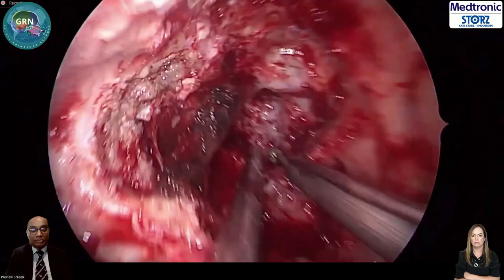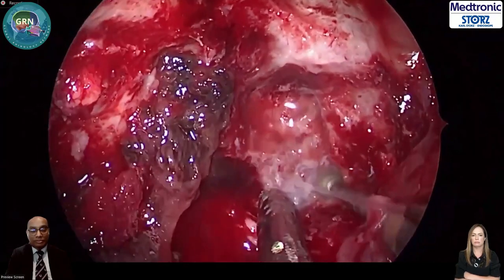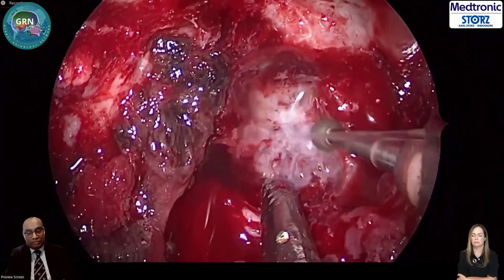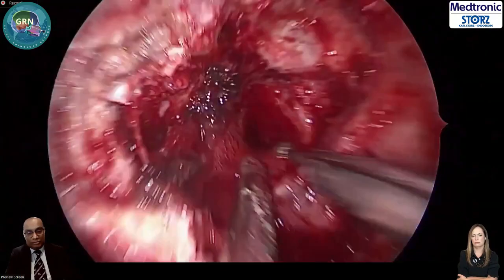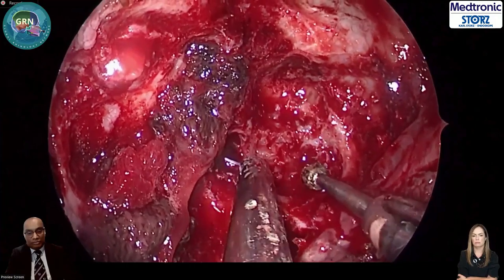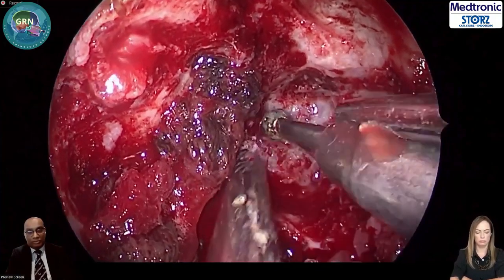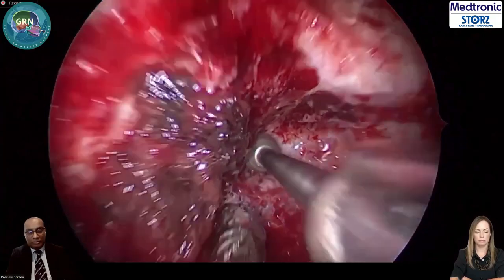This is an invasive tumor going inside. So you should be very careful not to leave behind any. So the big JNAs, the stage 2, all that is so easy to operate. It's just a cakewalk. But these invasive cases, they go into the small crevices and cause recurrence. And that's where you land up. You think that you've done a complete job and finally land up in a recurrence. So you see that there's another one hiding there. Go closer, please.